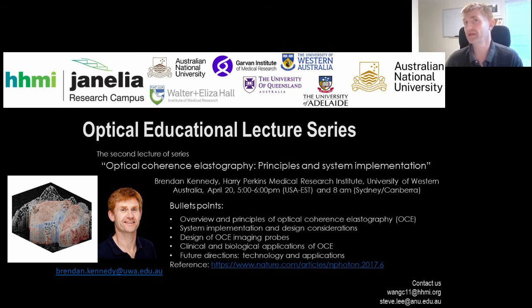In our current case, we've got a resolution for the in vivo probe of around 15 microns, and we can scan an 8 by 8 millimeter by 2 millimeter volume in around 3 seconds. We've figured out a way to reduce that to around 0.9 seconds. So that's the kind of scan rates we can get with our system. The 250 kilohertz A scan rate is really the rate determining step for OCT. That's the ultimate limit on speed.